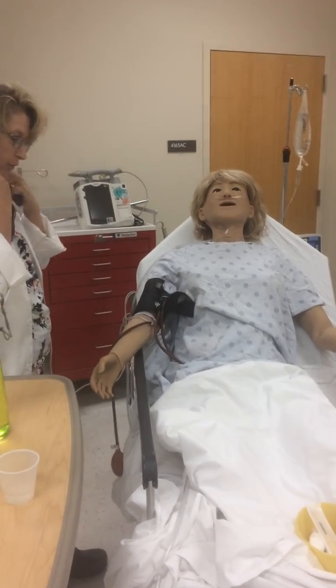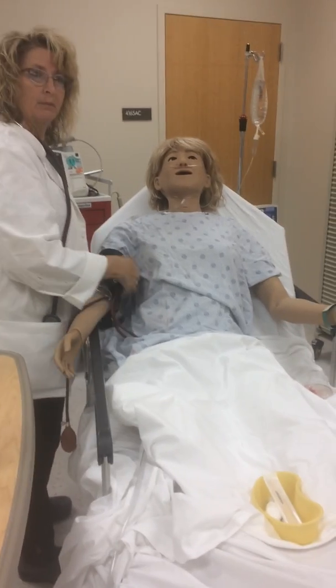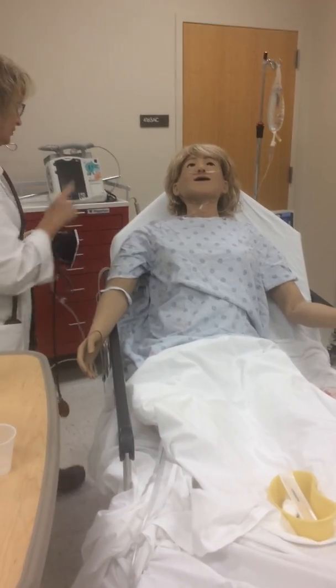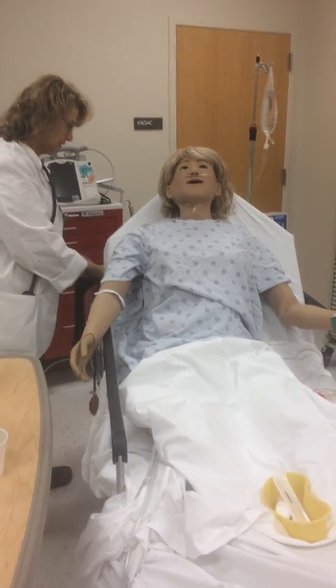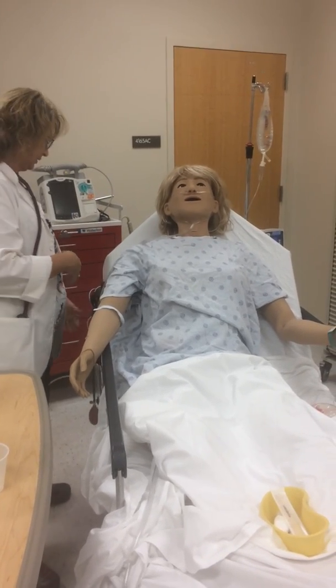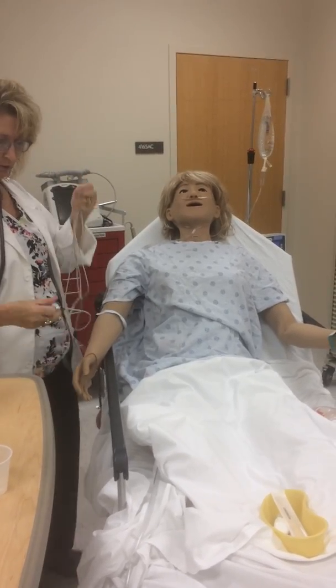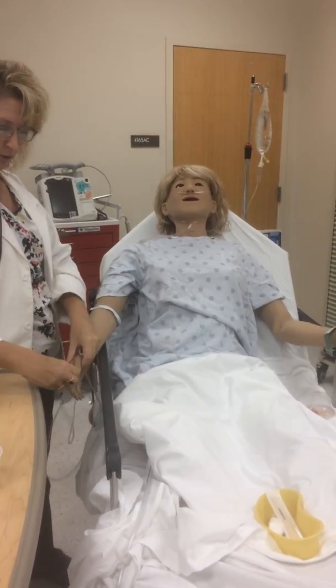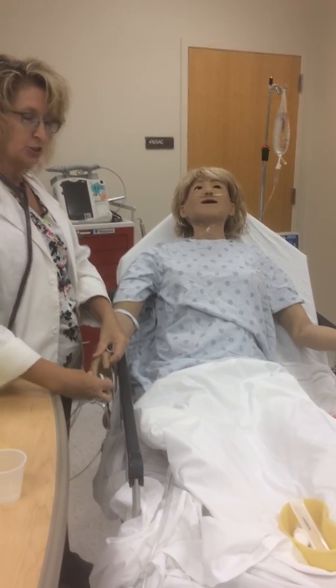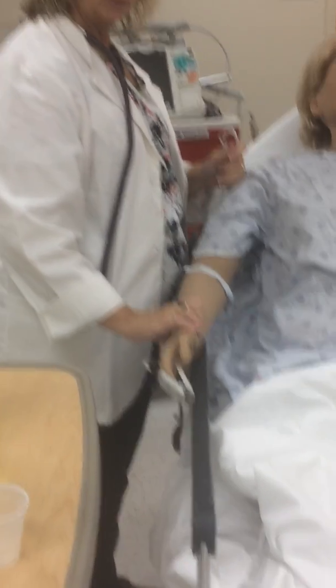Okay, I've got 130 over 80. That's about what it usually is. Okay, and if you notice, I've kind of worked on both sides of the patient and in communicating with her on both sides, so that kind of helps me know her hearing as I'm working. So I know that she can answer me on the other side. Her hearing was pretty good, and she's answering me on this side as well. So I'm going to get your pulse.